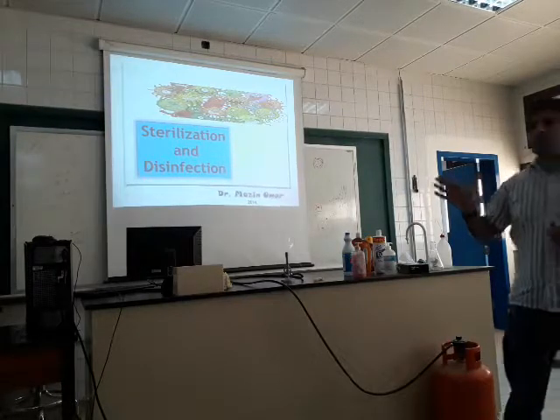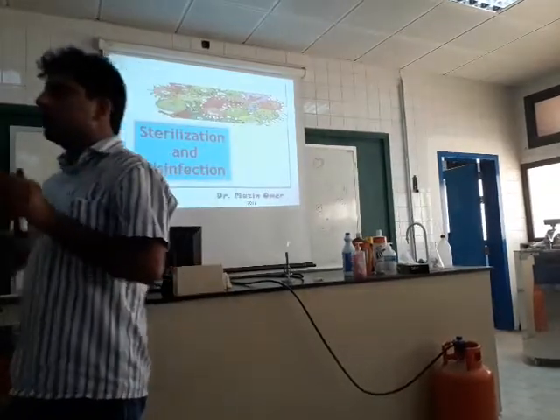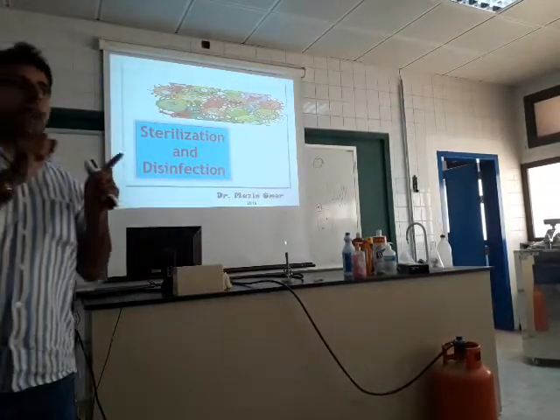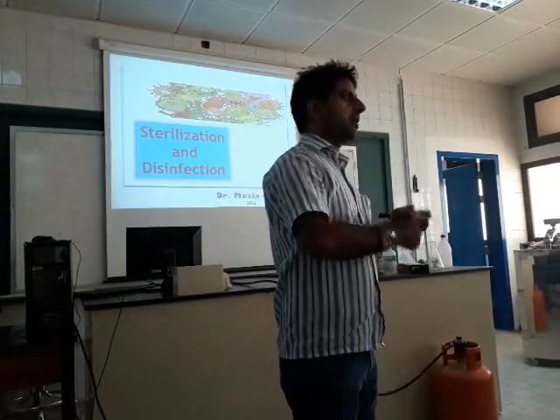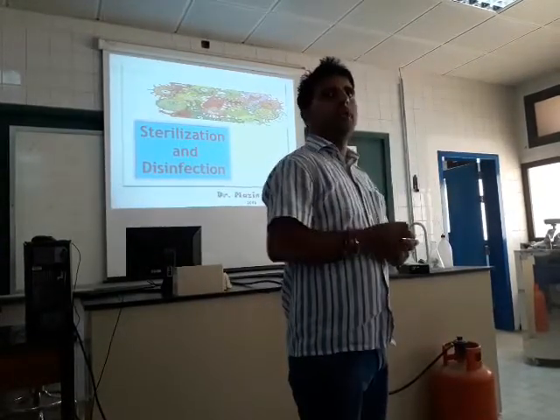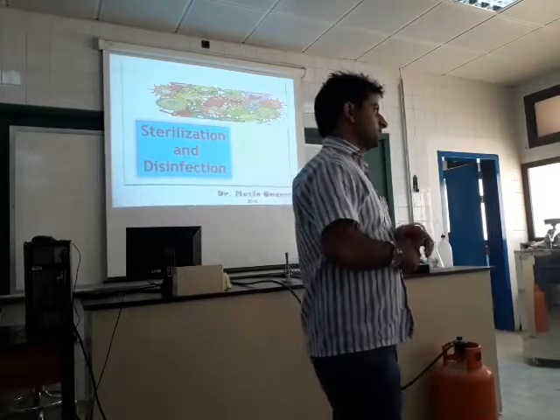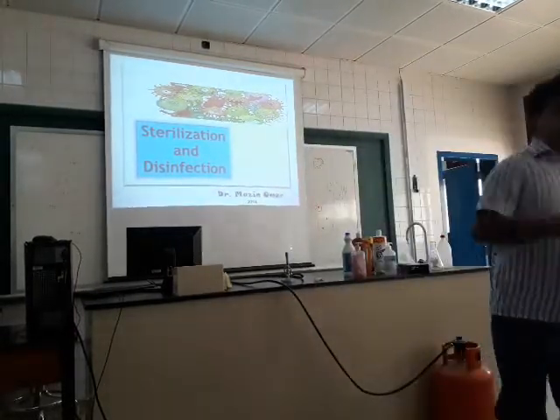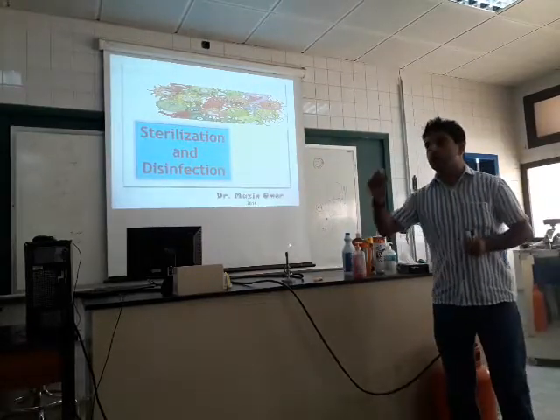The purpose of sterilization and disinfection is to make sure that the equipment and instruments used in the hospital and in dealing with patients are free from microorganisms. The bed lining where the patient is lying, and the bed itself, should be free from microorganisms.